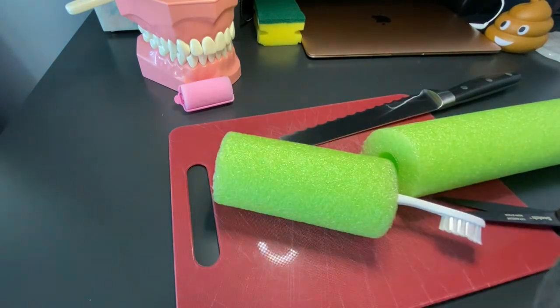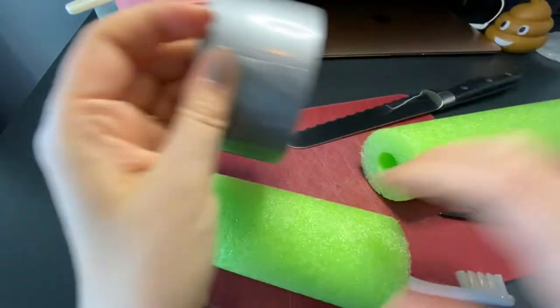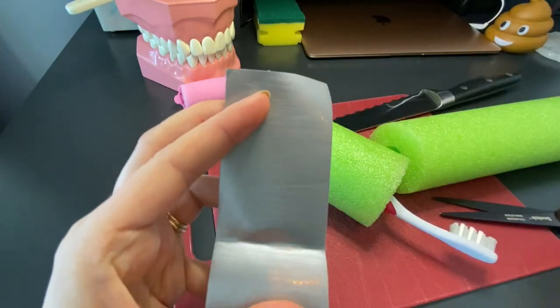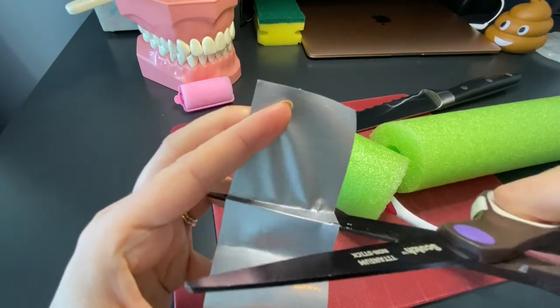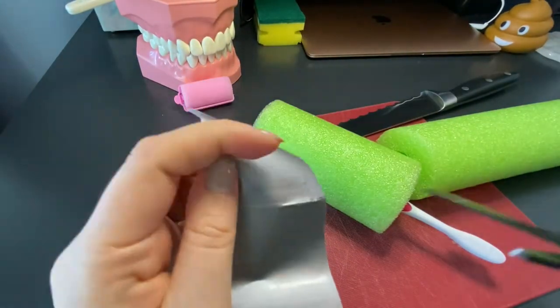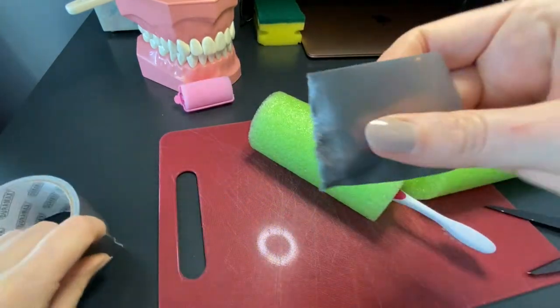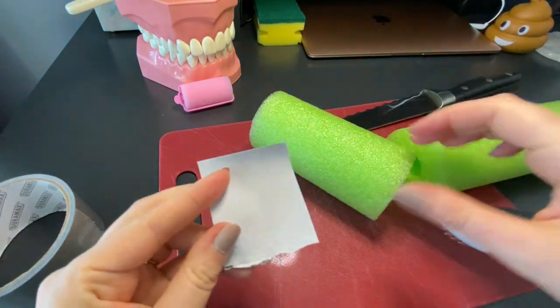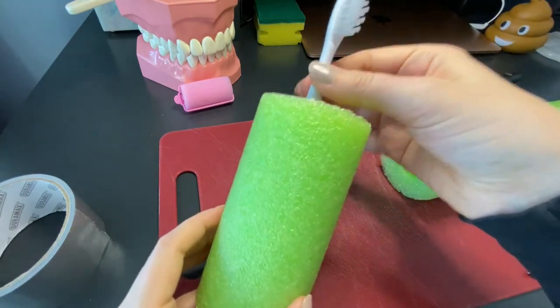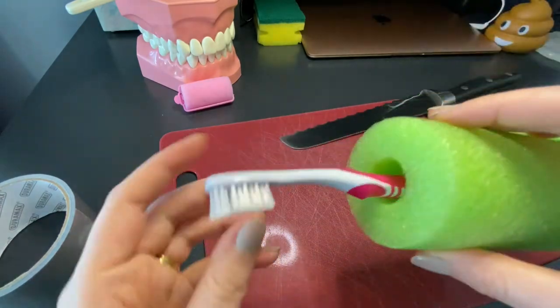If the pool noodle has a wider circle and the toothbrush slides right through, that's not ideal, so at this point just take some duct tape and cut off a piece. This is going to go on the bottom so the toothbrush doesn't fall through. There we go — sometimes it can fall out, which is why you might want to put a little bit of tape at the top as well.